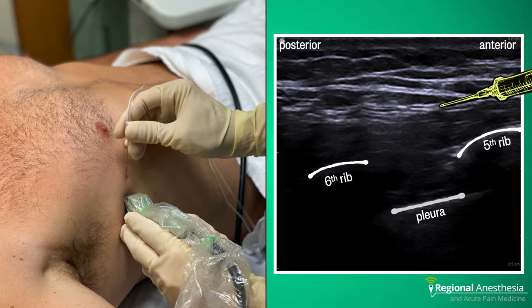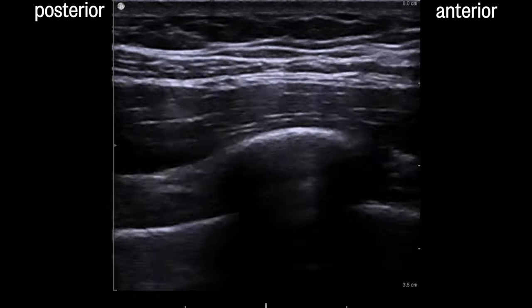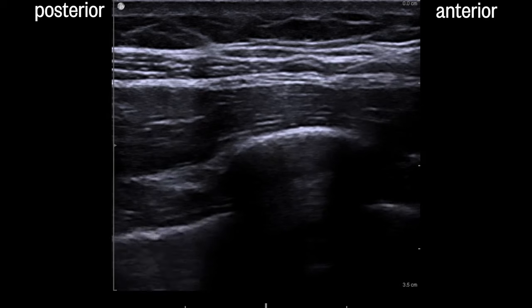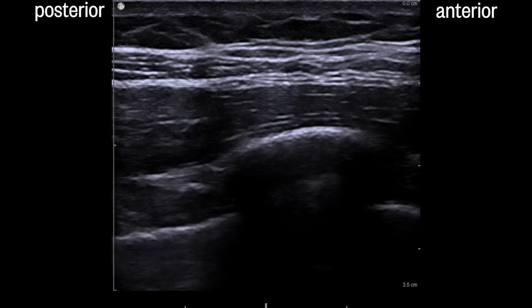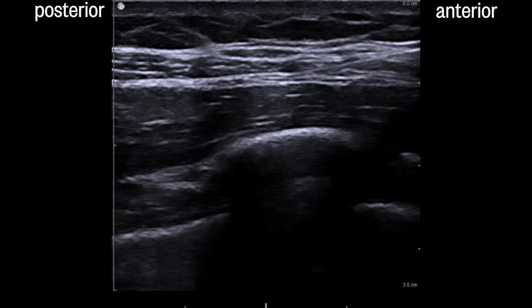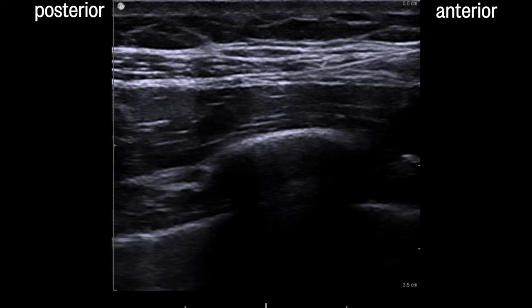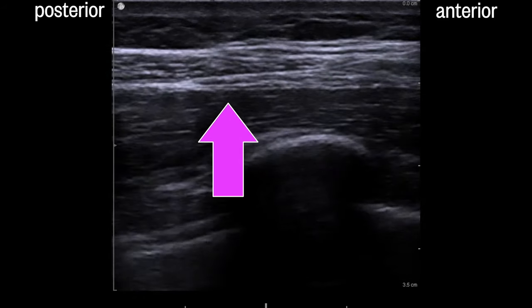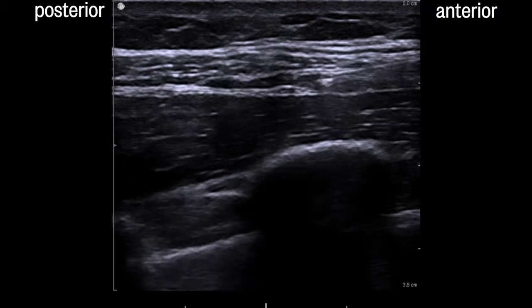Let's look at this in real time. Here we see the fifth rib with the pleura on either side and two distinct muscle layers above: the serratus anterior muscle — note that it gets thicker as it gets more posterior — and on top of that, the anterior edge of latissimus. The needle is advanced from anterior to posterior, carefully negotiating its way into the plane between the two muscles. You should make an effort to locate and avoid the thoracodorsal artery, which lives in this plane. After negative aspiration, a small amount of saline is administered to test that the needle is in the correct fascial plane.